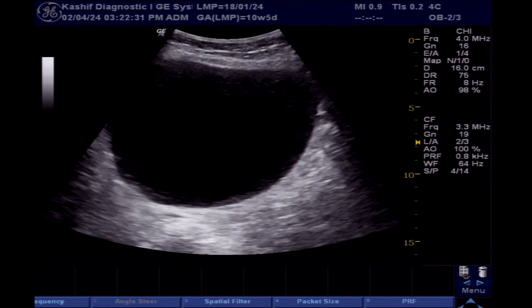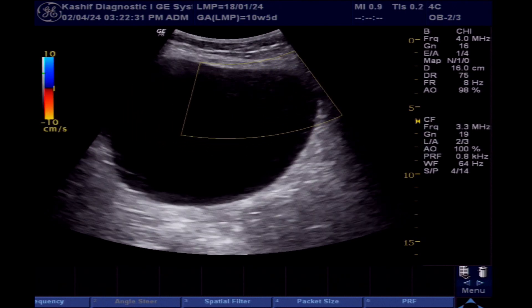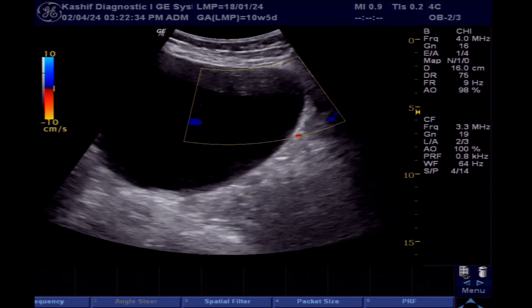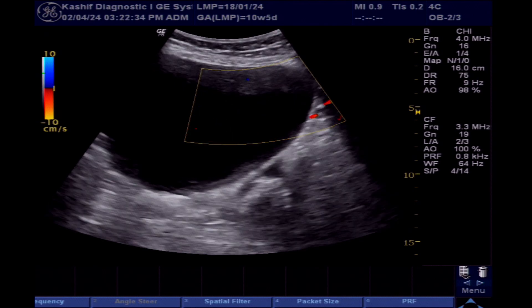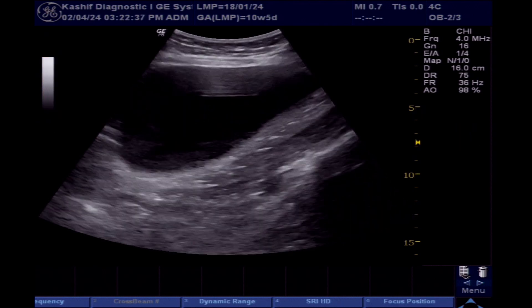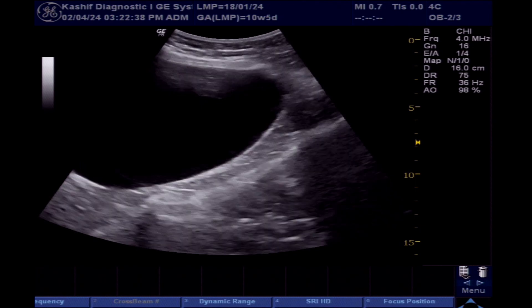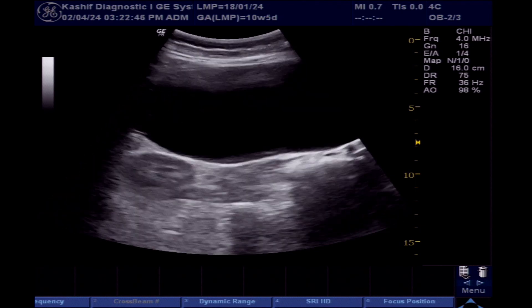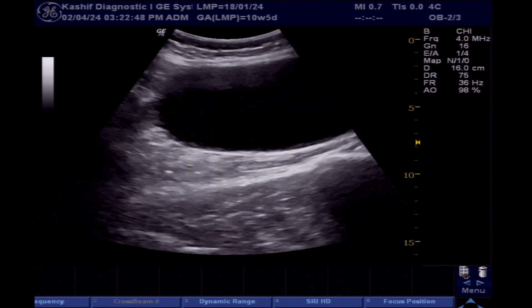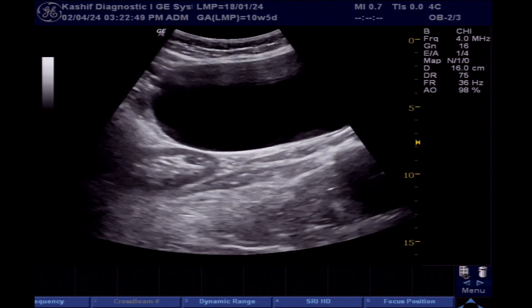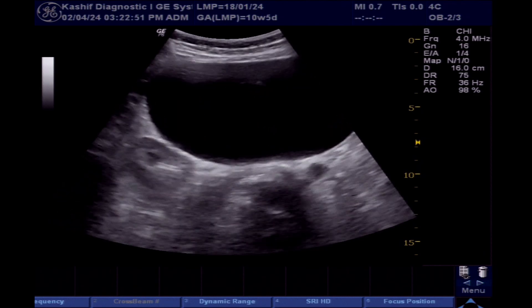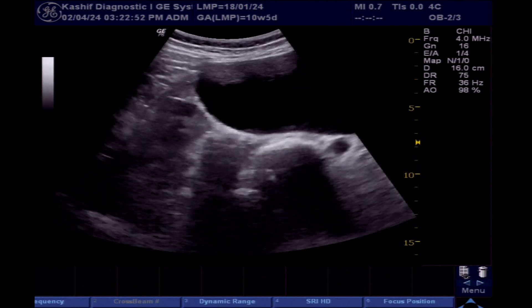It has a thin and smooth wall. It is movable. There is no internal vascularity. This is filled with clear fluid. There is no internal strand and no internal septa seen. There is no internal calcification or echogenic component. No internal solid component is seen in the cyst.